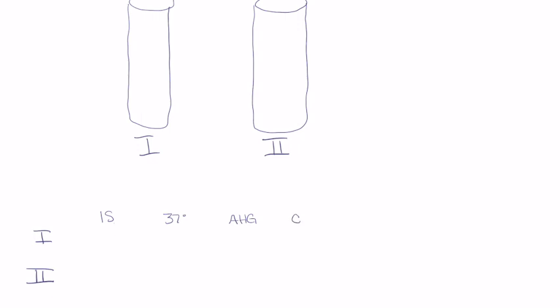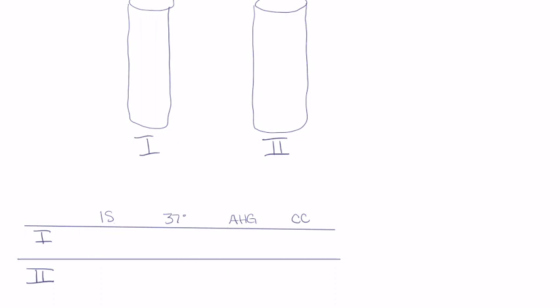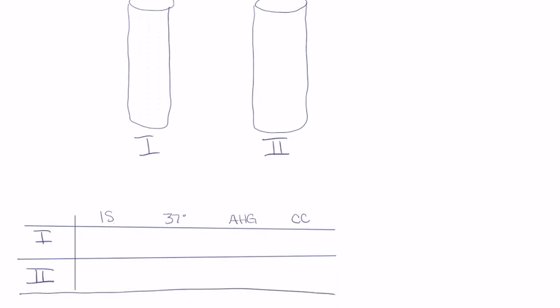And then we're going to put a spot here for our Coombs control cells or our check cells. Okay, and we're going to have a little chart for that, and we'll record our results, and then we'll have an interpretation at the end as well. Okay, so let's go ahead, we'll get this ready, and now let's talk about what's going on inside these cells.